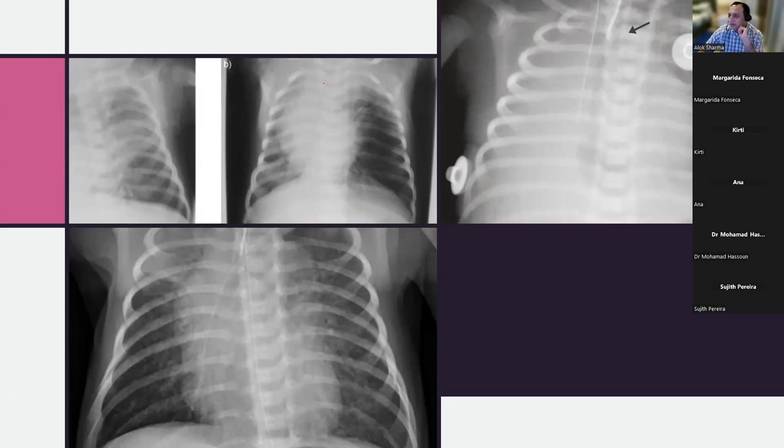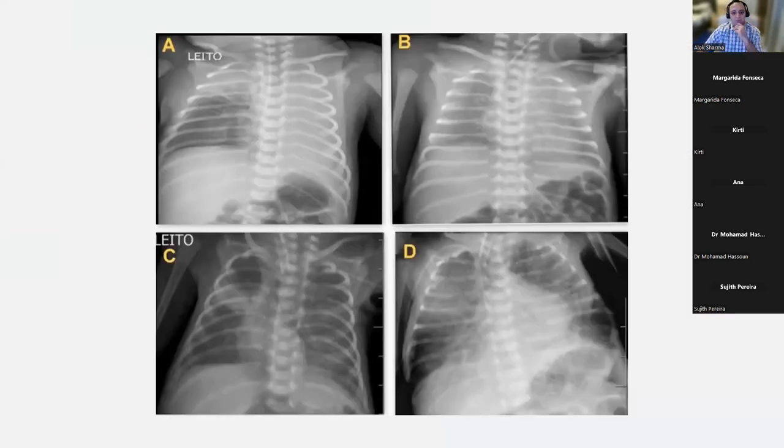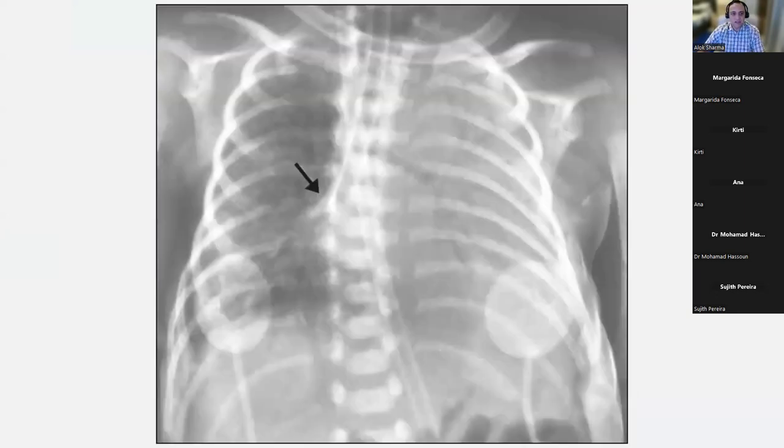On the other hand, what you can see over here again is rib crowding with what is not clear-cut opacification. So you don't have a whiteout, but definite hyperinflation of the other lung. So again, the question is, what is happening on this side? Is there a collapse consolidation on this particular side? Or is this hyperinflation which is causing the mediastinal shift because there's something wrong with this left lung? And I'd say that lung ultrasound is much more sensitive in the diagnosis of atelectasis as compared to a chest x-ray. Now, these are just other examples of neonatal atelectasis, which I'm going to skip.